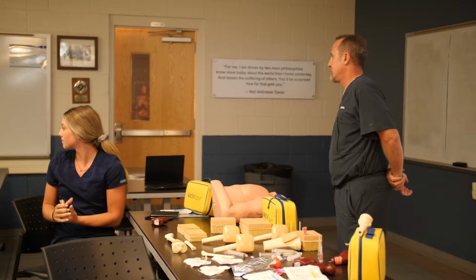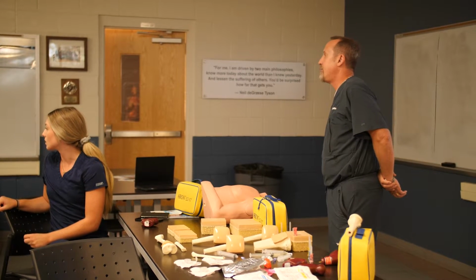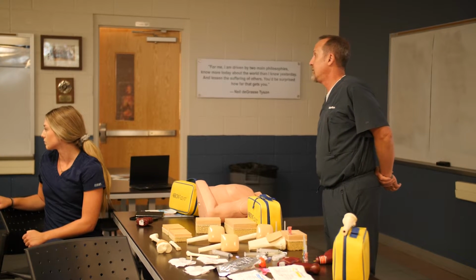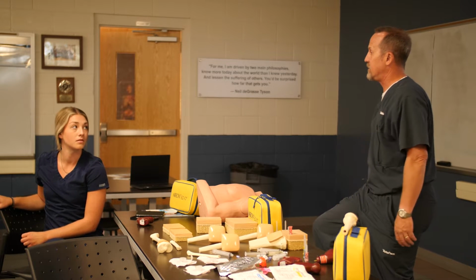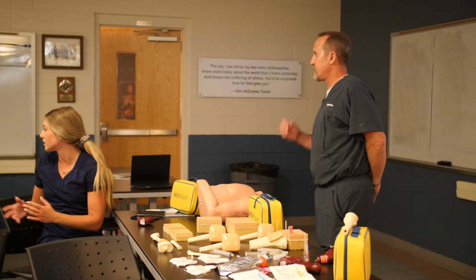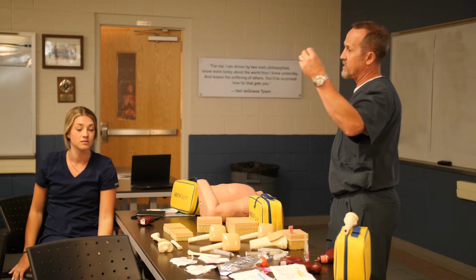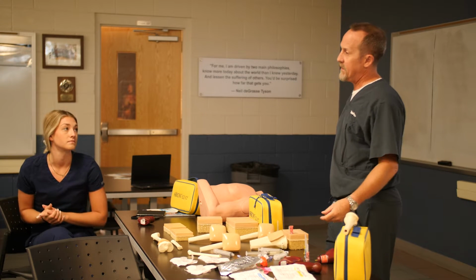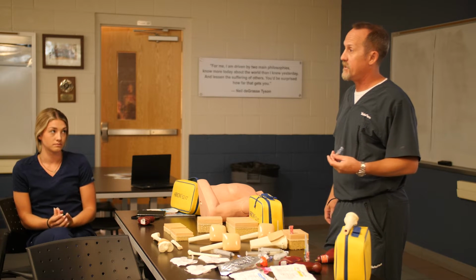Just eyeballing it, the pink may be too short, especially going into the femur. So blue is probably more appropriate, especially if they've just got those chubby little legs. And again, that weight range is 3 kilograms and above, so it can be used on pediatrics. That's the beauty of being 3 kilos all the way up: it's going to work for any patient population the pink needle will work for, but it's going to give you a lot longer length for tissue ranges, okay?